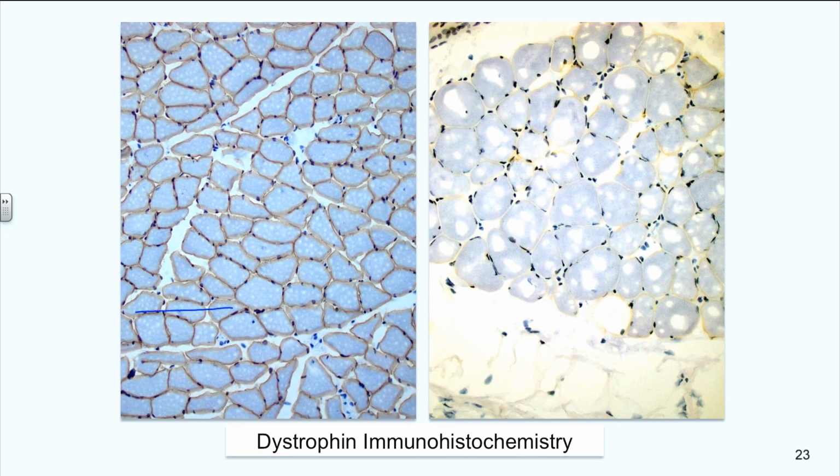In this patient, we did the immunohistochemistry for dystrophin. One of the components, I'm sure that I am representing here the one that came out abnormal. Normal control to make sure the technique worked on this side. And you can see that the myofibers are surrounded by brown colorimetric reaction, so the protein is there. However, in this muscle from the patient, you can see that there are many fibers that lack the protein. And in some of them, there is an attempt at a little bit of coloration of the protein.